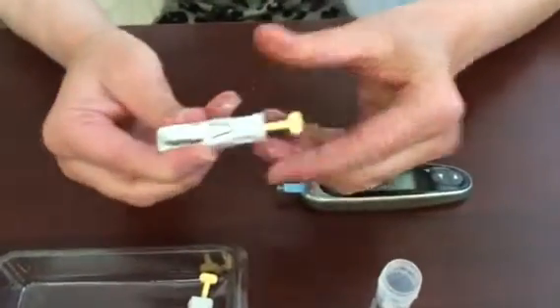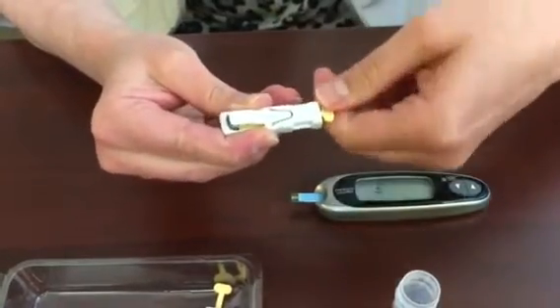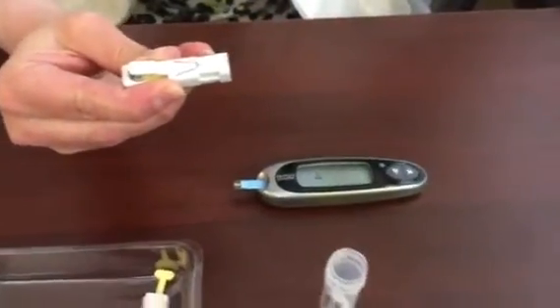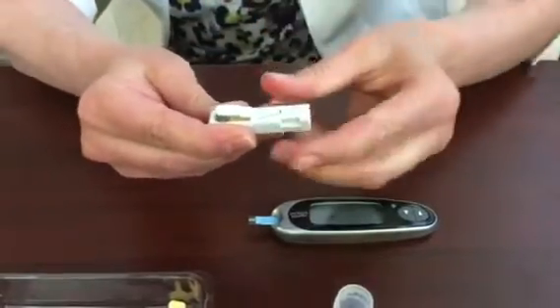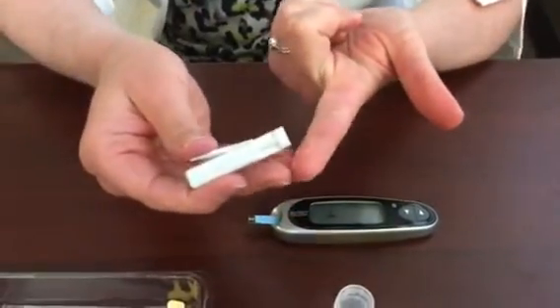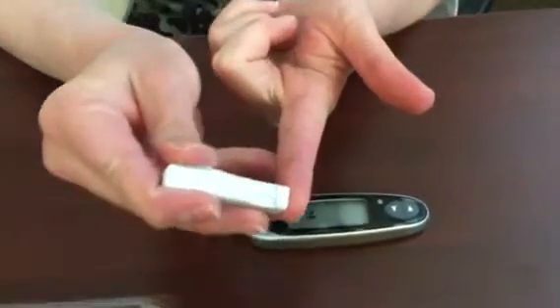The next step is to take out a single use lancet and push the yellow stem here into the body of the lancet until it clicks. Then we're going to gently twist the yellow tab until it comes off and discard that piece. The part where the yellow stick came off is the part that's going to go against your finger. You would swab your finger — I've just washed my hands — and you would place the lancet firmly against the end of your finger where the yellow stick came out, and then you will press the trigger.